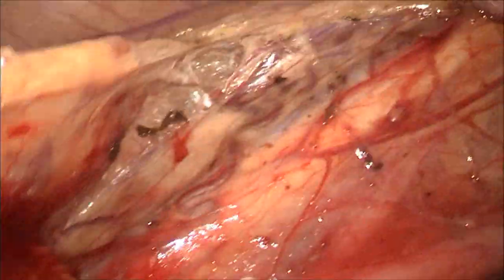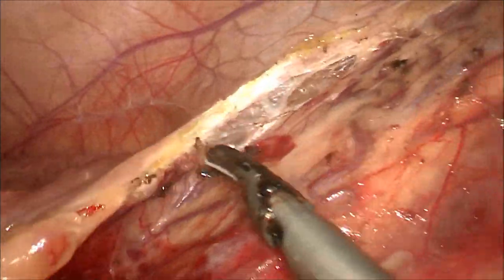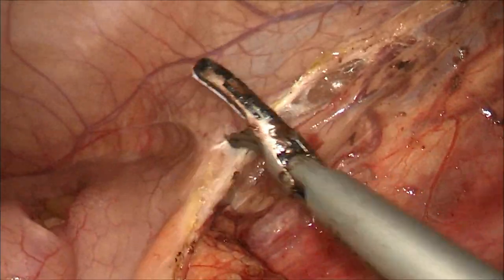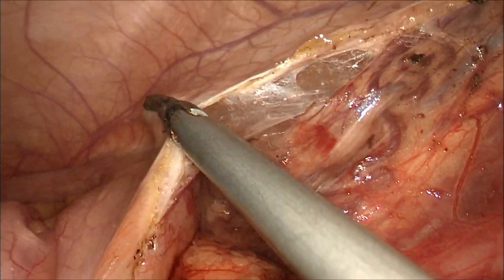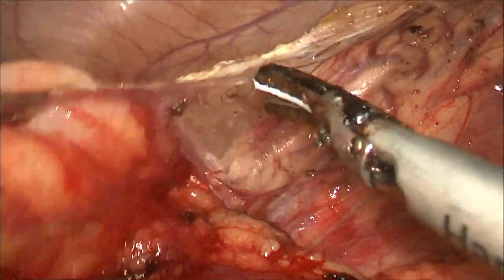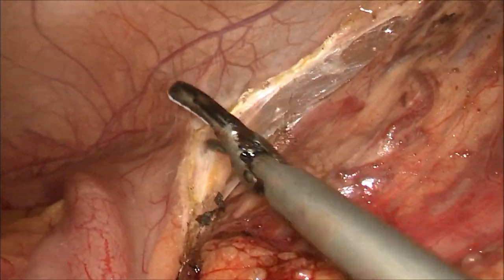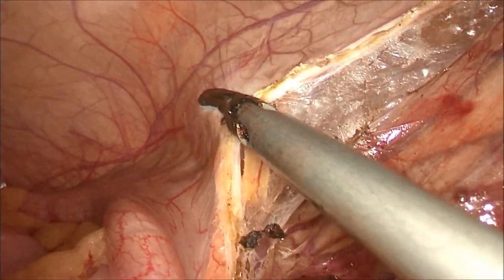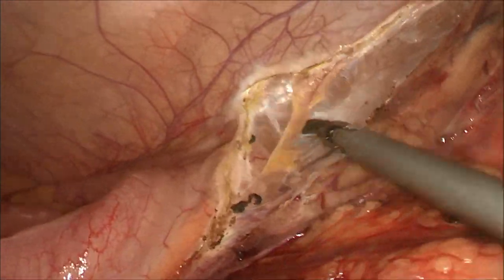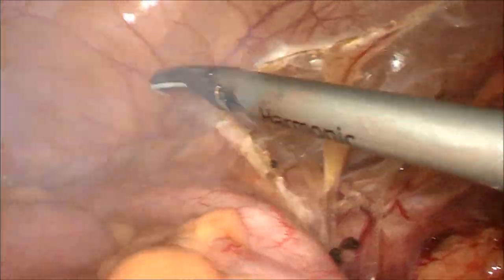The incision on the lateral peritoneum is then extended cranially from the sigmoid onto the descending colon up till the splenic flexure. However, no lateral to medial dissection is done — only the peritoneal fold is incised, and the splenic flexure and the descending colon will be mobilized from medially to laterally, as we do for a right colon mobilization.